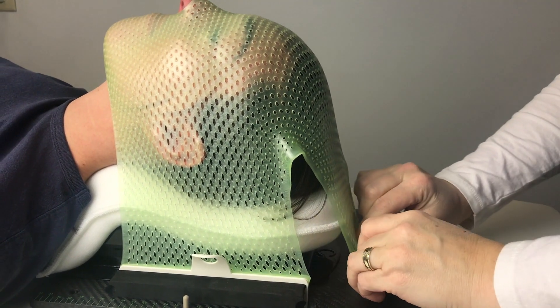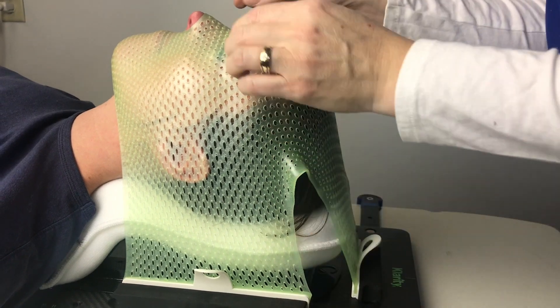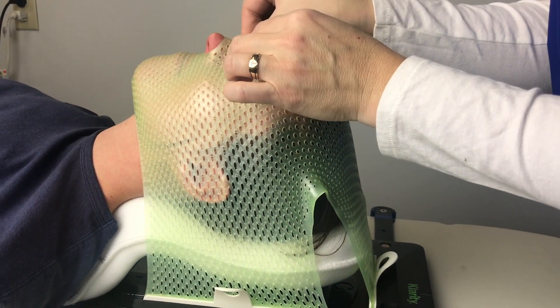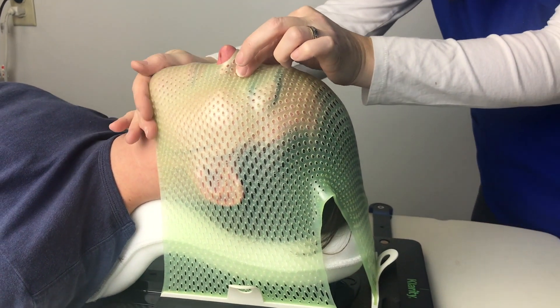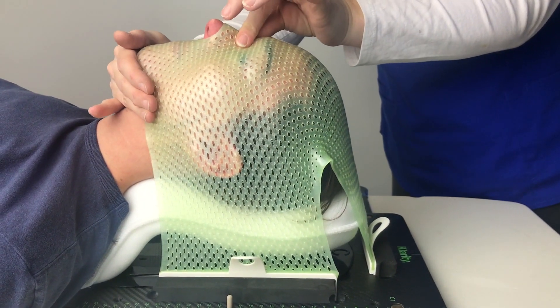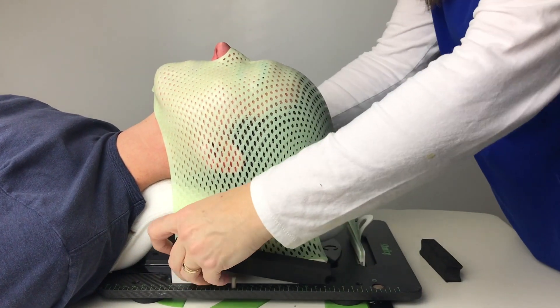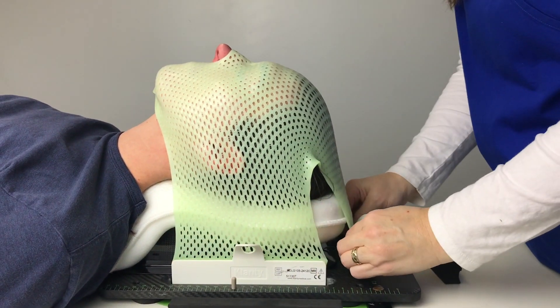The Clarity Green Thermoplastic can then be formed stress-free as it gives you a longer working time to ensure the mask is accurately contoured. Once the mask is cured, you can remove it from your patient to store for future treatments.